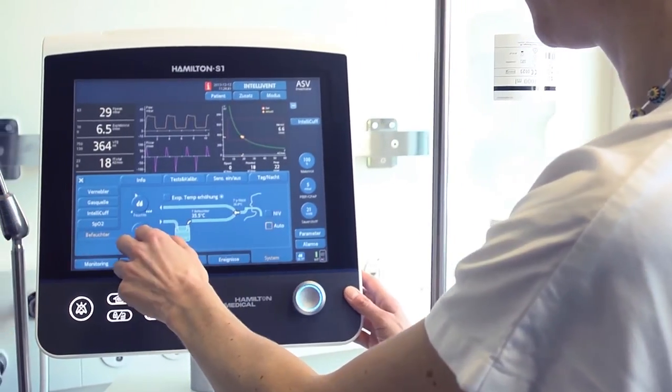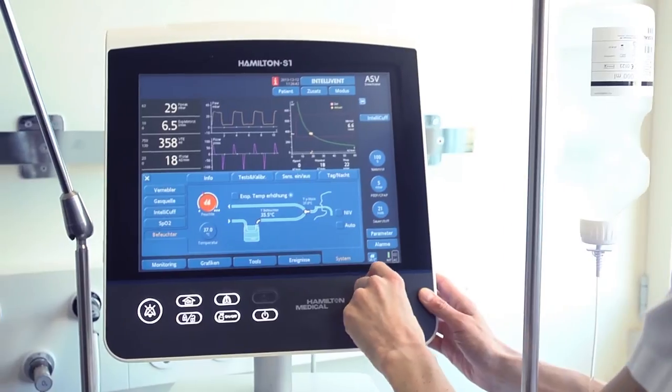I don't have to stoop down to operate the humidifier. Instead, I can interact with it at eye level using the ventilator display and tell it what to do.